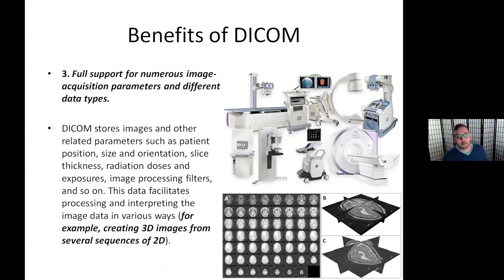DICOM supports all the different imaging modalities, not just ultrasound or fluoroscopy, but CT, all these different things are driven by DICOM. And it stores different parameters that allow you to manipulate the data in different ways. One of those ways is creating 3D images from a group of 2D images. I don't know if we're going to do that project, but if you're interested and you want to do a project, I would love to help you learn how to turn an image stack of 2D images into a three-dimensional image using Python.